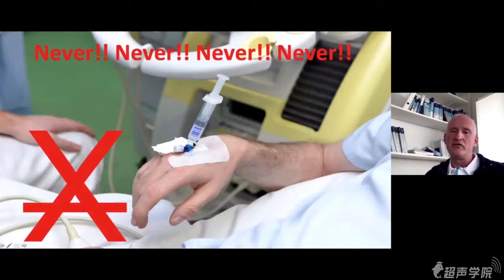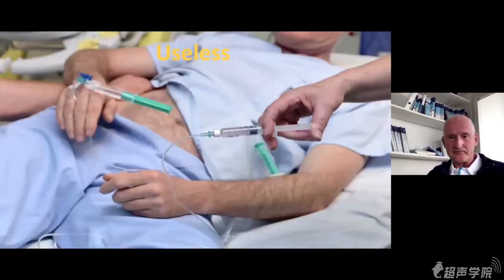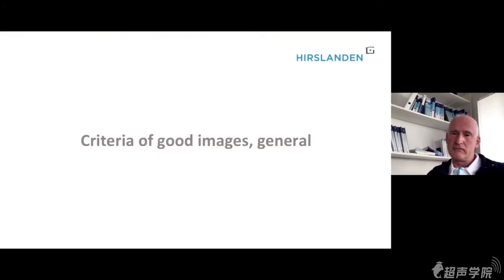Never give Sonoview via the filter distally in a small cannula. You might destroy the gas bubbles and the results are not as good. Useless are the extension line and the 3-way stopcock, and some use it. They may use it, but we never do.